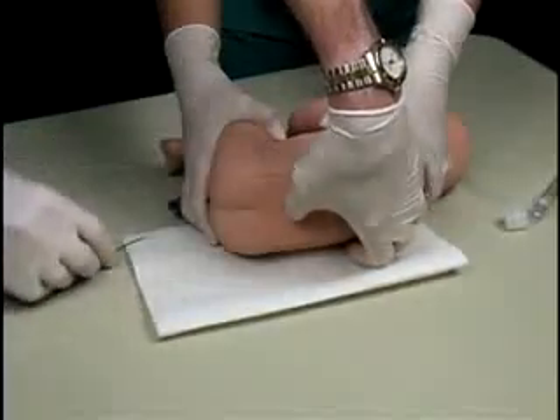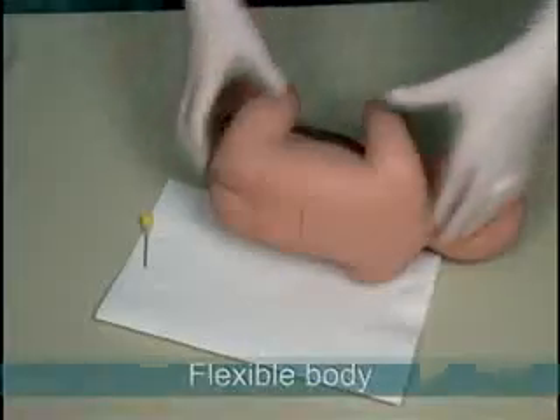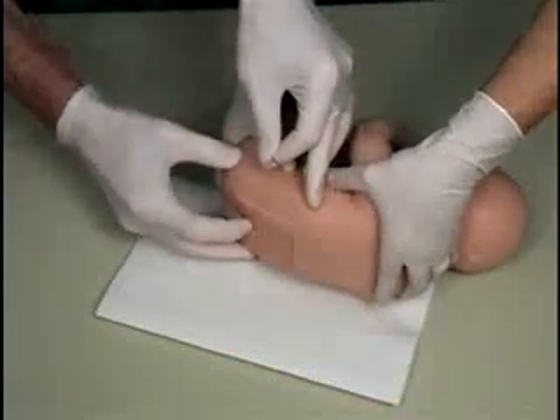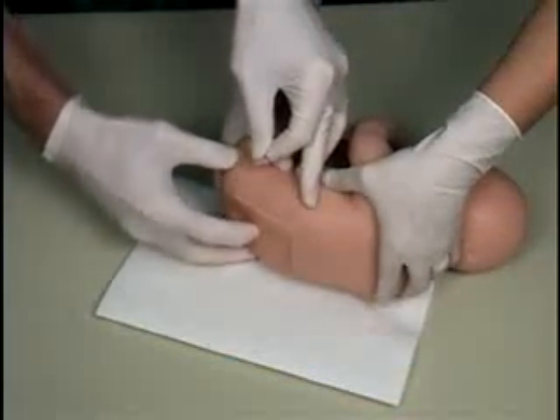Lumbar Puncture Baby's flexible body allows users to simulate the process of articulating the vertebrae and moving the interspinous process from a neutral to an open position.